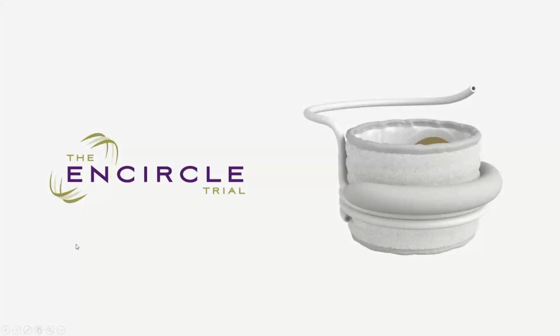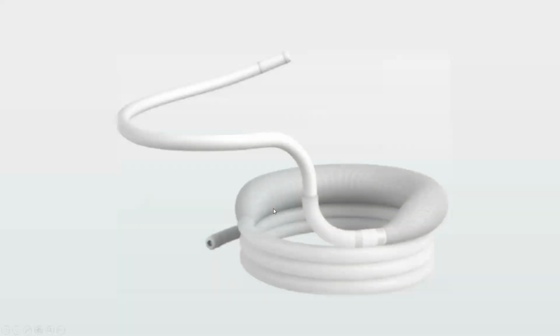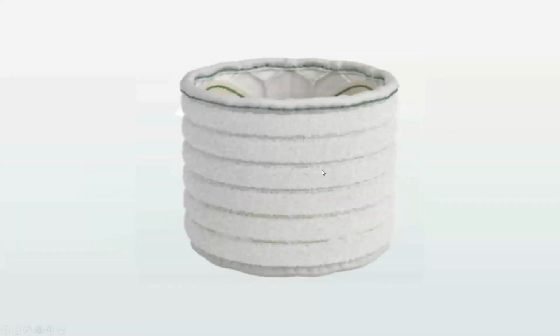But the device that was available to us at the time was the Edwards M3 valve through the Encircle trial. So this valve basically is designed with the concept of a valve and ring procedure. You have a dock, and the dock has a leading turn that basically grasps the subvalvular apparatus of the mitral valve, and then two additional turns, and then there's an atrial portion that has a PVL guard and an atrial arm. The valve that's implanted is identical to the SAPIEN 3 number 29 valve, except that it's completely covered externally, which allows a good seal between the device and the docking system and reduces the risk of PVL.